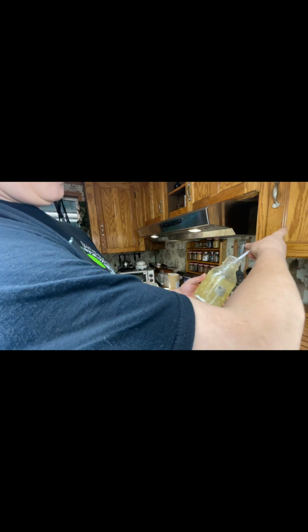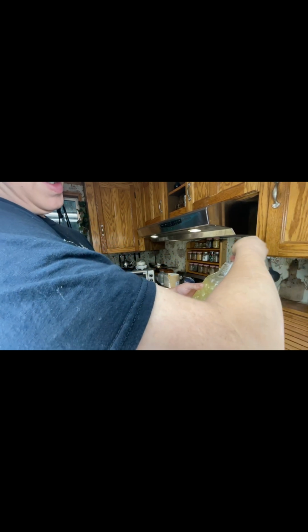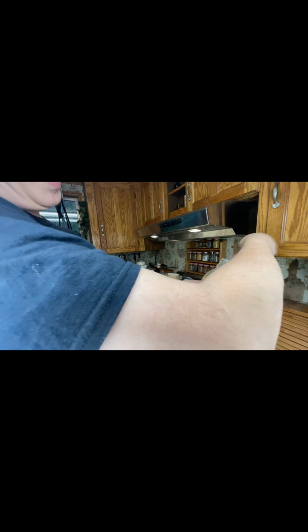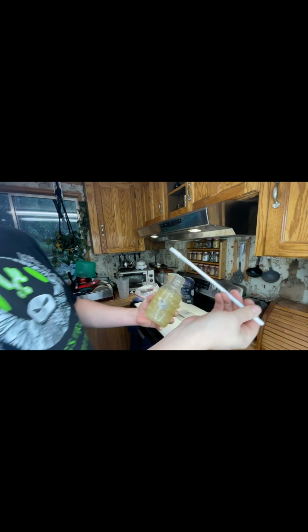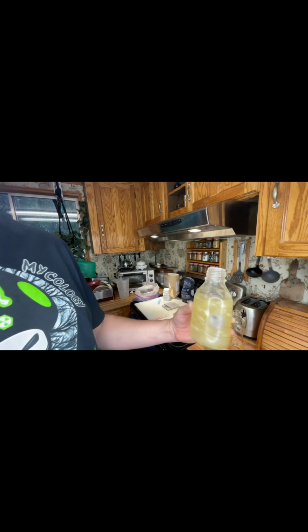So now, before I get going too far, I'm going to go ahead and break off as much of this chunky stuff as I can off the side. As much as you can get into the liquid, it'll be nice. You know, it still looks bad. I would say that this batch, I probably could use less Gellan gum, more like 10 or 11 grams, but we'll see when we get it all cooked in. It'll look a little different.